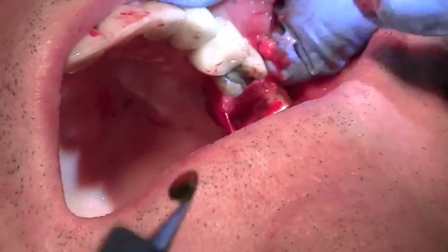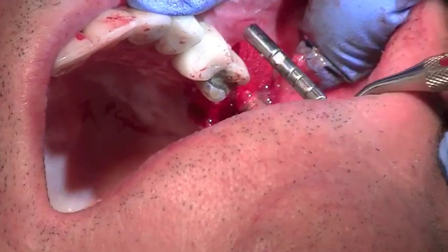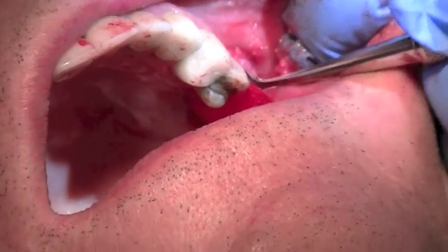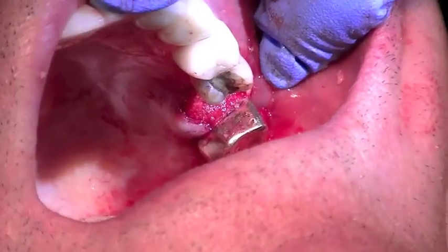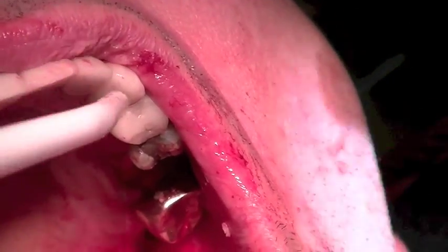So you can see how nicely that looks and I'm able to take my membrane and position it over the bone. And now I'm going to tuck it into the buccal. The key is for my barrier to lay flat — you can see how nice and flat it is. And now we're going to place a suture.